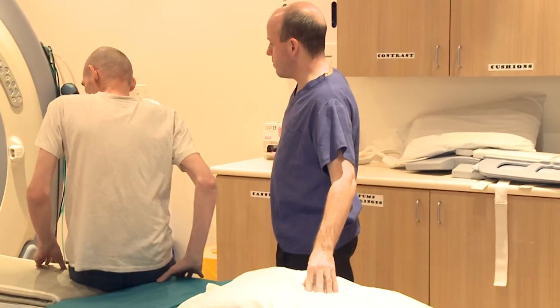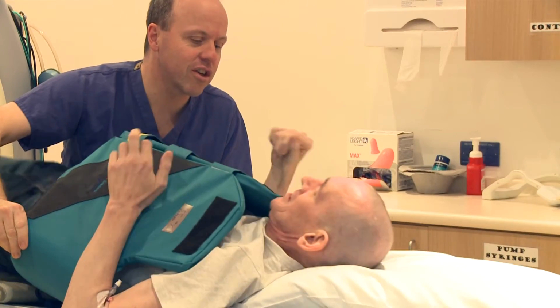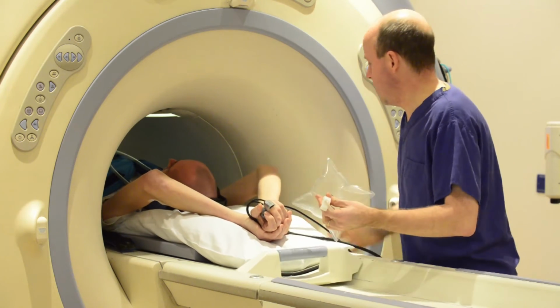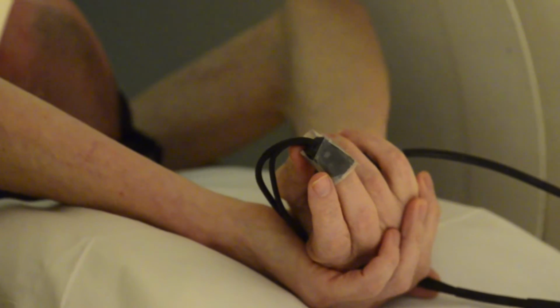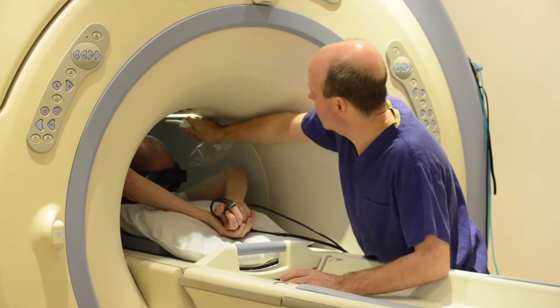I'll have 3 MRI scans with about an hour in between each one. And you're fitted with a kind of jacket thing that fits over the top of you. And then you have a pulse monitor, an oximeter, I think, on one finger. And then the technician will pass like a little see-through plastic bag with a tube on it, which he passes through and you put in your mouth. And you breathe the gas in through that. You just breathe it all in until it's gone, and then hold your breath while the scan's done.